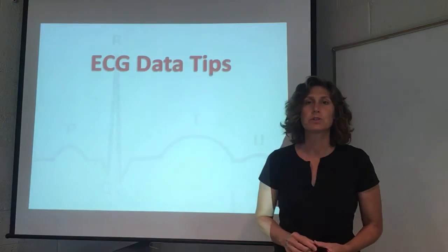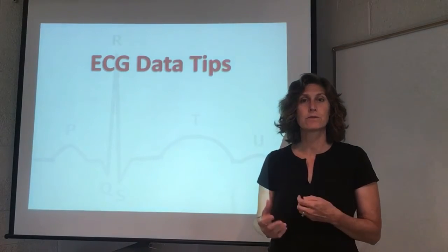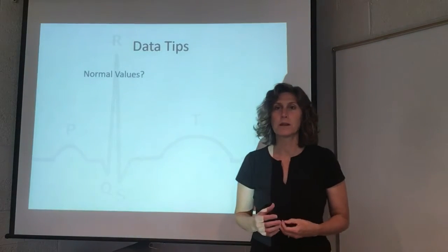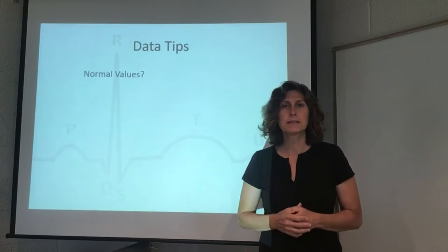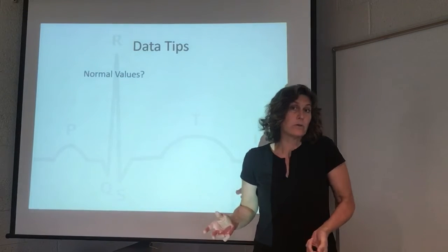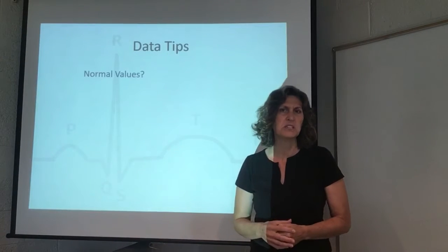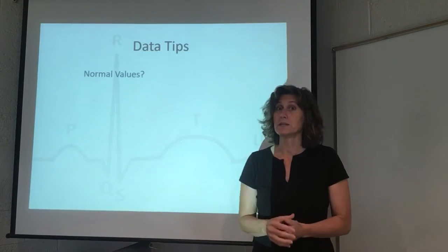This segment will introduce some tips for how to read your ECG data and how to interpret the data. It's important as you go through this sequence of labs to start to get an intuitive sense of what is a normal value. So if somebody asked you after you've gone through this class, what's a normal value for ECG? Well, first thing you'd have to ask is, what aspect of the ECG?